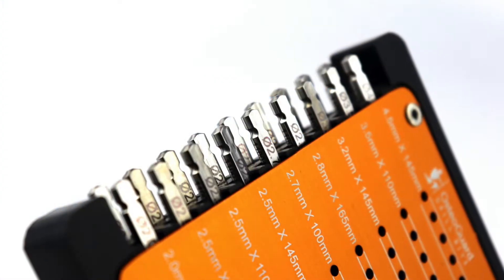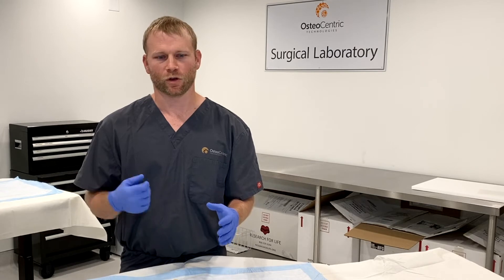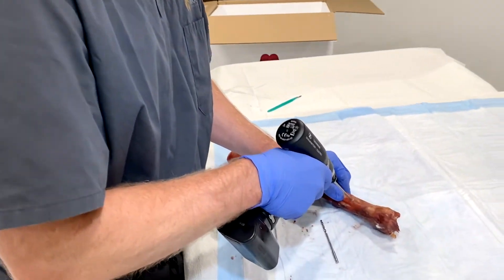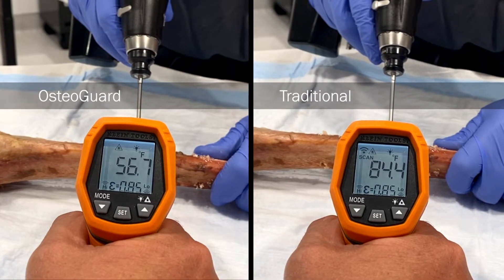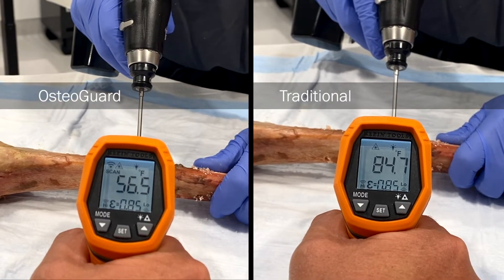I've mainly noticed that the drill bit itself, it's much easier to drill across a cortex of a bone as opposed to the other drill bits that I've been using prior to using the Osteoguard. And the benefits of that are less heat generation, so I've noticed less smoke coming from drilling cortical bone.